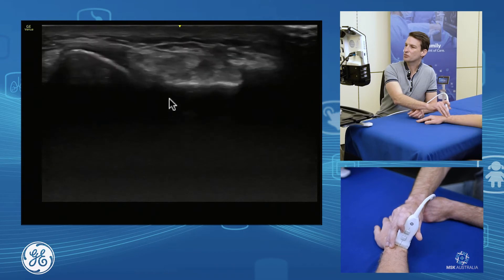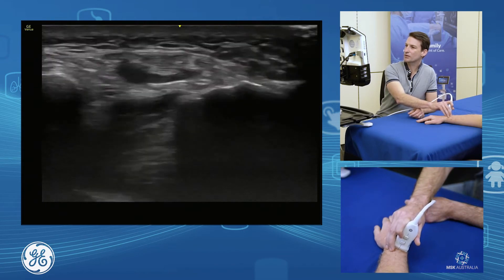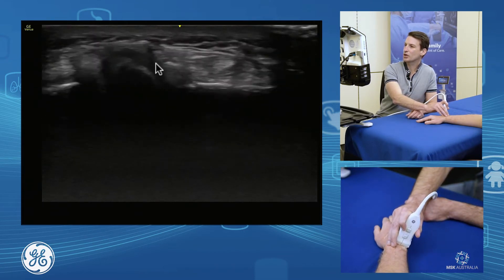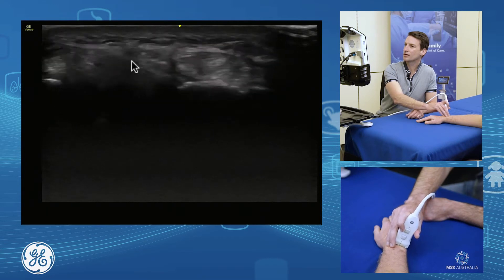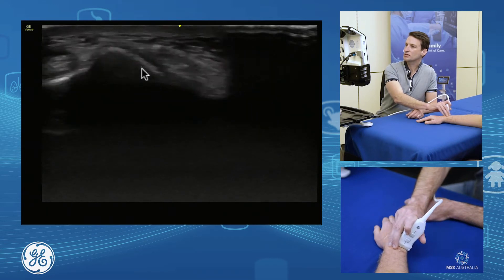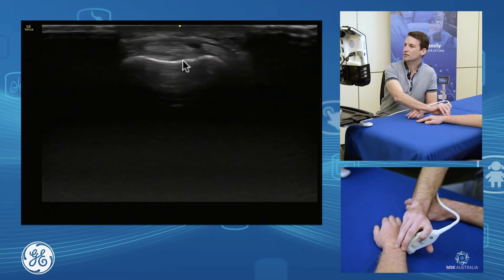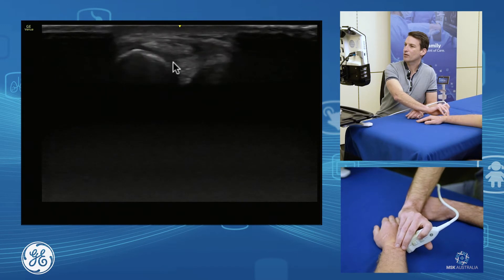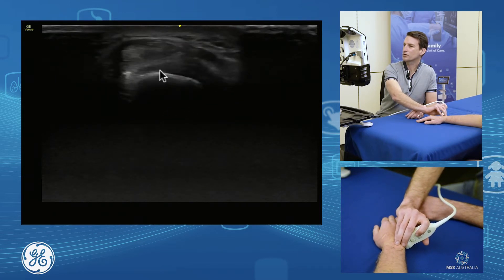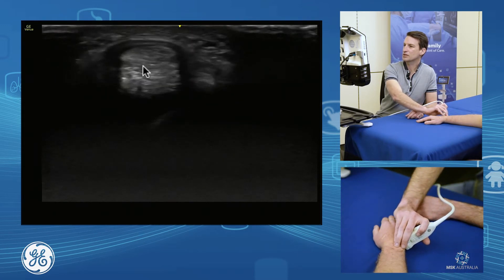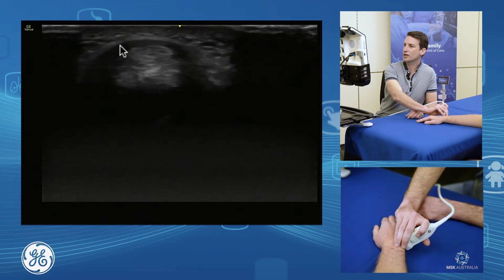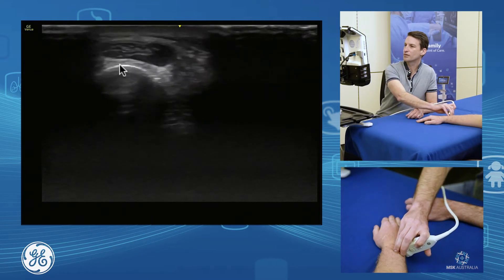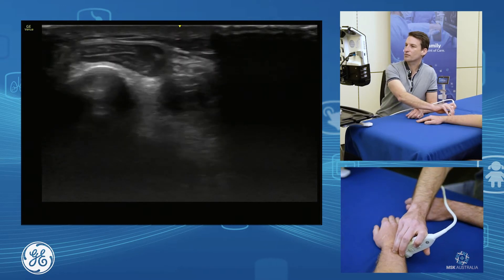As we move over to extensor compartment five, we have our extensor digiti minimi running through there. And as you continue on over, we see our extensor carpi ulnaris running through, sitting in its sub-sheath, over in the groove and up through the muscle.